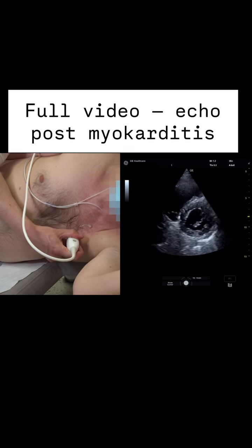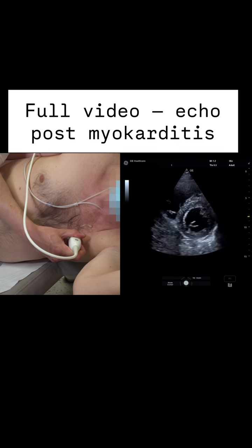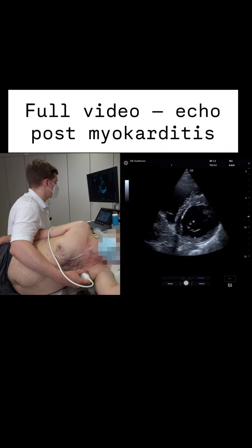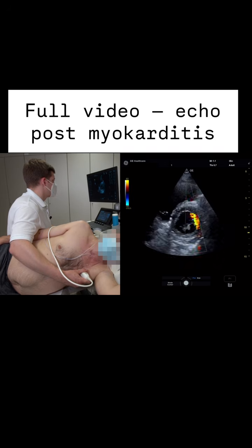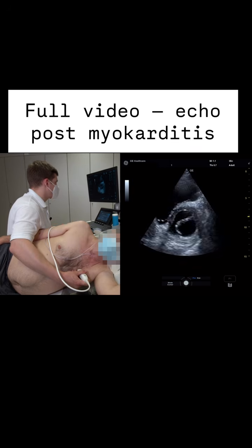We tilt the transducer downwards, and when we tilt it down to the level of the papillary muscles, this is the mitral valve, we have the anterior and the posterior leaflet of the mitral valve. Also here you can switch on color Doppler to see if there is really a mitral regurgitation. We see probably again a small flame. We have to verify it in a 4-chamber view though.